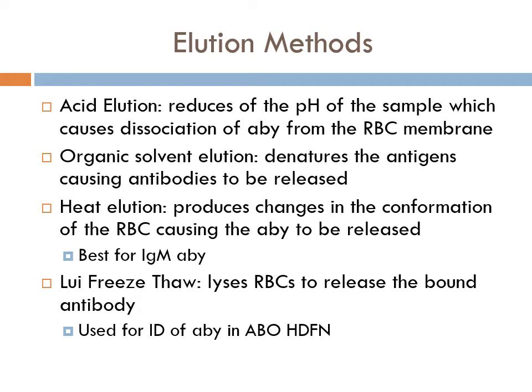So we're essentially breaking the RBC up, for all we have really is like a hemoglobin mixture in there with potential antibodies. So kind of nasty to read, but really good for doing that, ABO-HDFN antibody identification.